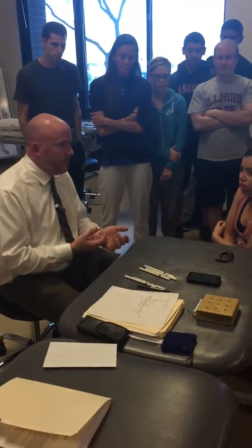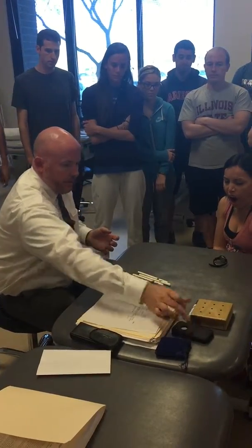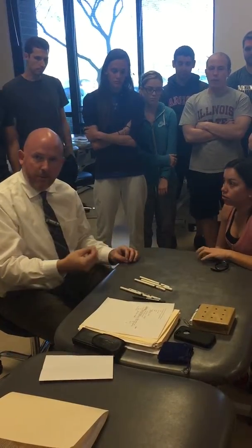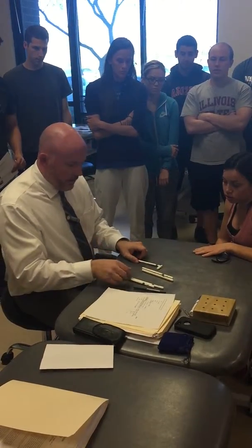Sign for, say, the carpal tunnel and the median nerve. You also want to be able to say how much of a sensory loss there is, especially if they're describing that their fingertips feel numb or they just don't feel the items that they're trying to pick up with their hand. So each of these monofilaments are of a different size, and this is a very uniform test.